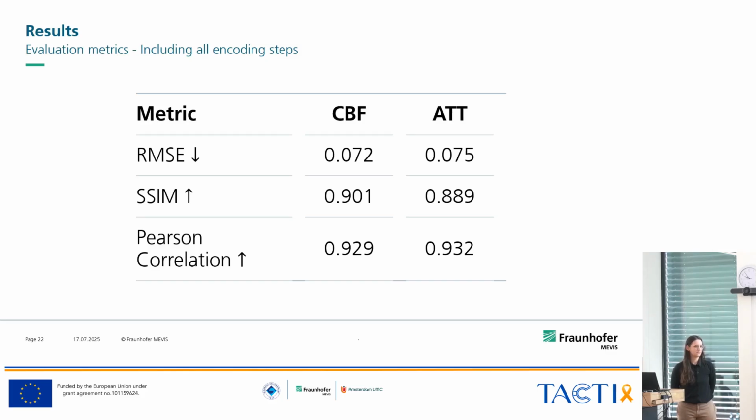And if there would be a change in contrast, that would mean that the CBF or perfusion estimation would be different as well. So the ultimate goal is that there is no change in contrast, because contrast does tell us how strong perfusion is in the region. So spatial resolution is definitely the same. Contrast, with these metrics, is not 100% the same, yes, but pretty much the same.